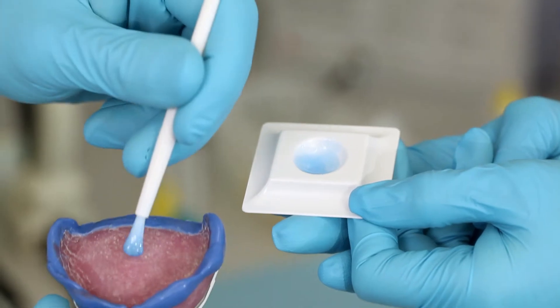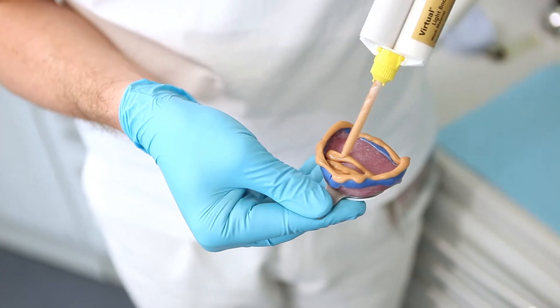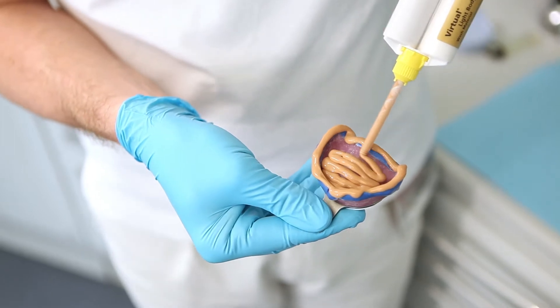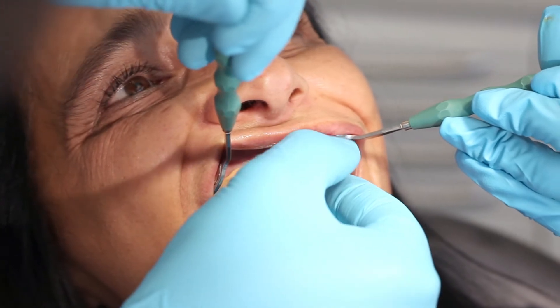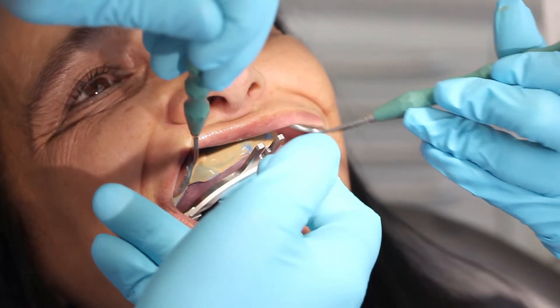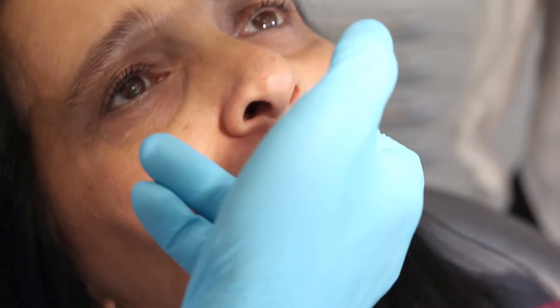After having coated the inner surface of the tray with adhesive varnish, apply virtual light body for the basic or wash impression. Insert the tray and lightly press it into place. It's important to remove any excess that is pressed out on the dorsal aspect immediately.